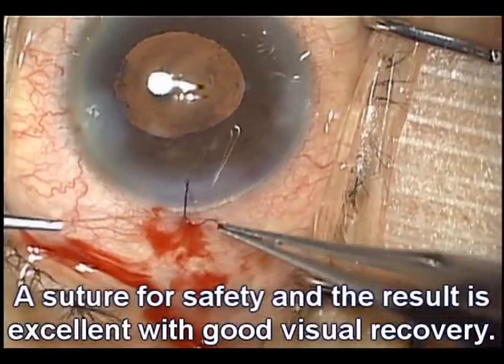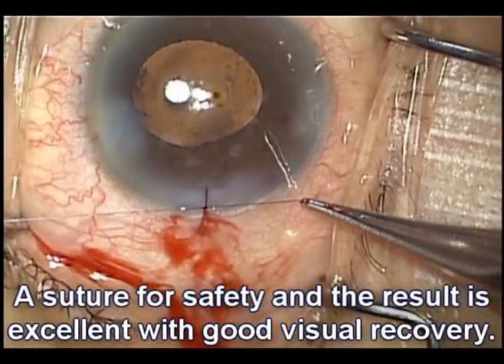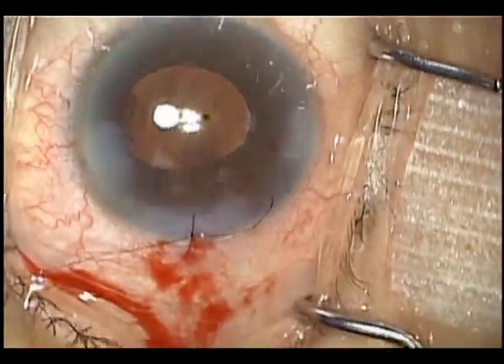Importantly, we'll place the suture just to be on the safe side. The patient has a beautiful result and a nice recovery of their vision. Close call that ended well.